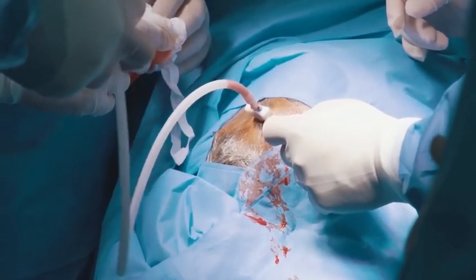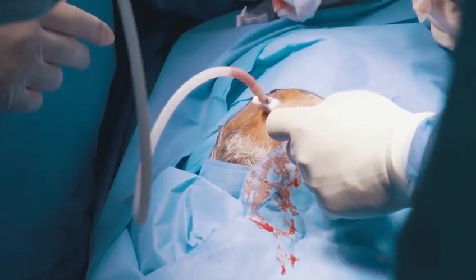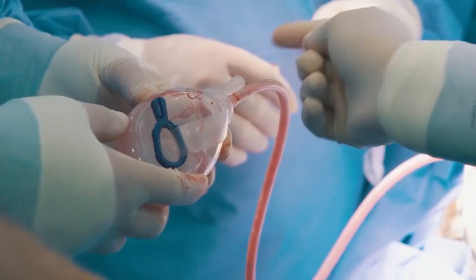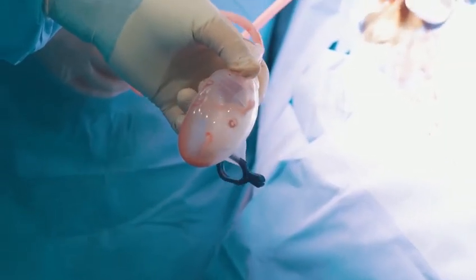Generally, insertion of one port is enough, but a maximum of 3, if needed, can be inserted without causing any adverse event, such as hemorrhage. Multiple ports may be indicated if there are septations in the subdural space, or the subdural collection is very dense, such as in acute subdural hematoma.